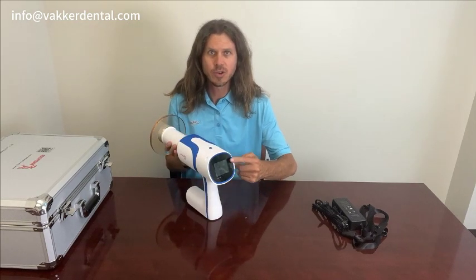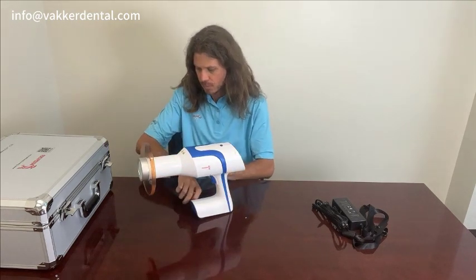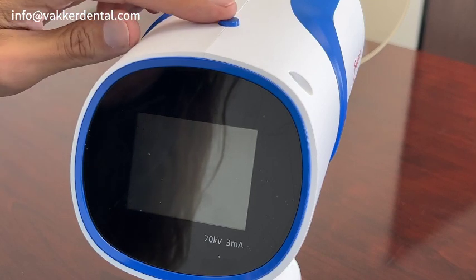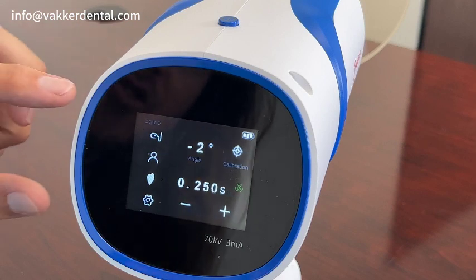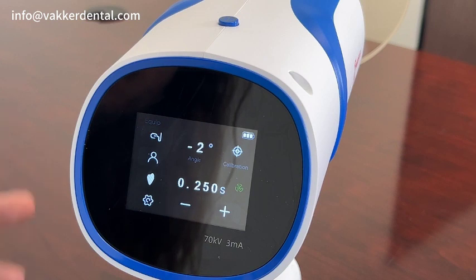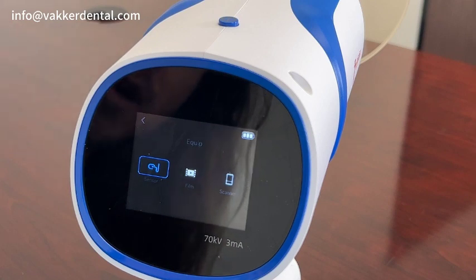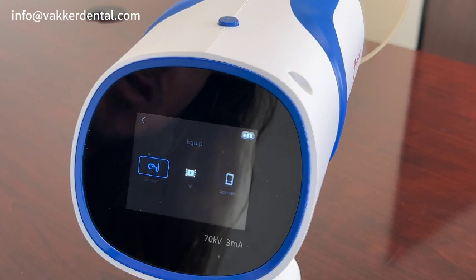Let me show you all the different features and how it works. The power button is on top — you go ahead and press that and it turns on. On the left-hand side you're going to have all your different options for features and settings. Going to the top left corner, you have the option to use sensors, film, or scanner, which will be your phosphorus plates. Most people use sensors, so we'll leave it there.